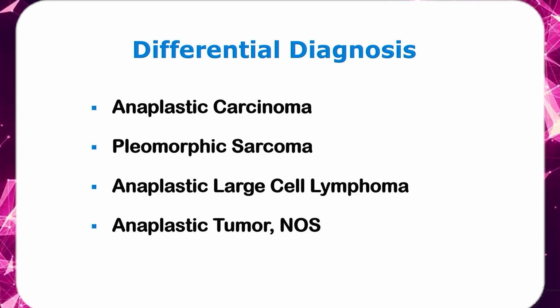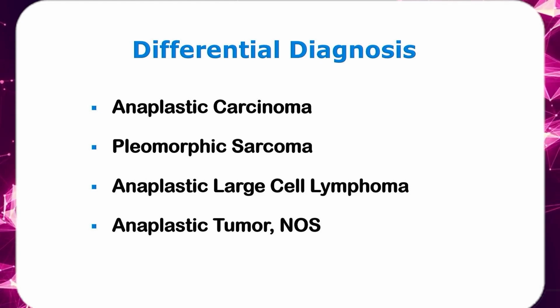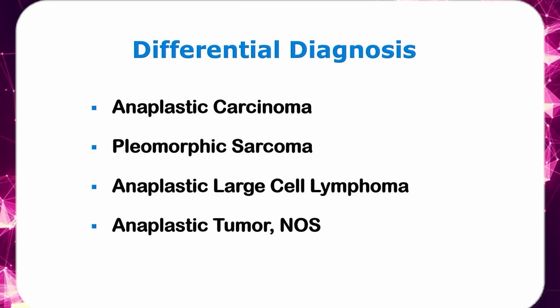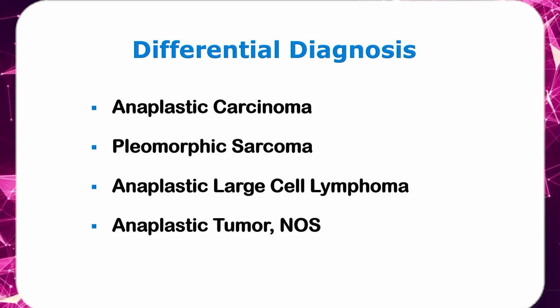I didn't even ask you that. Is the specimen adequate? So we all know it's adequate. Do you think it's abnormal? I'm sure you will say yes. Do you think it's neoplasm? Absolutely neoplasm. Benign or malignant? All of you will call it malignant. But what type?